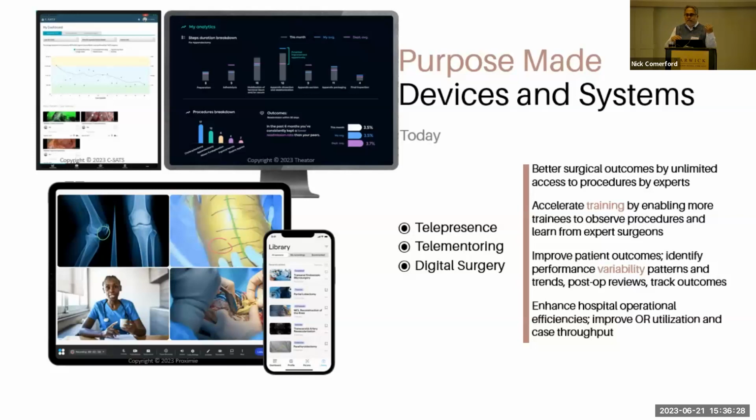But on those platforms, there are others that generate additional insights. Insights around the time of the surgery, around the amount of bleeding. They're running algorithms for the amount of bleeding, and generating insights into the use of the device, what type of device, and the placement of the device. So there are a lot of these insights that are generated, and today they're typically used to train new doctors.